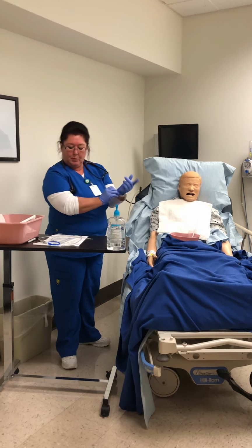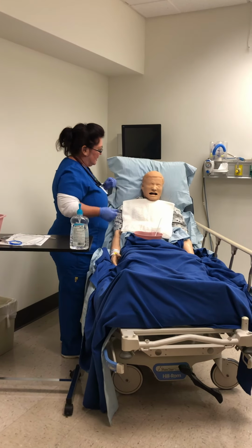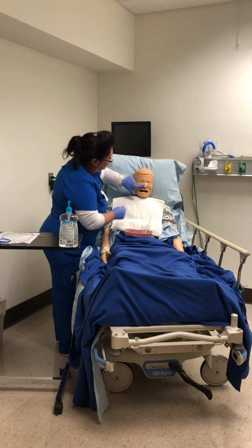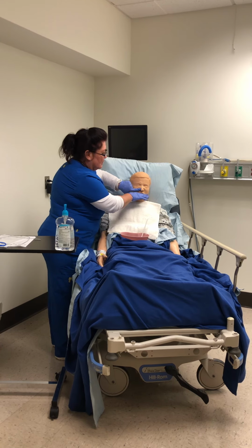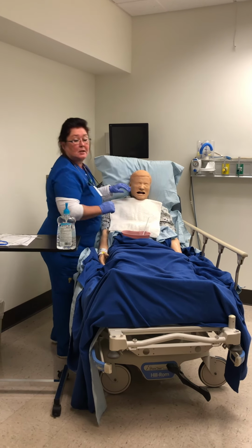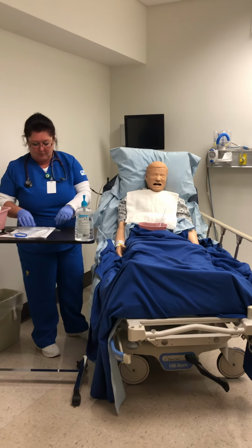Okay, and before we place the tube, I need to check the patency of her nares to see which one is going to be better. So, Shirley, I'm going to block this side, and if you could please blow. And this side and blow. And Shirley says that the right one feels better, so we're going to put the tube in the right nare.